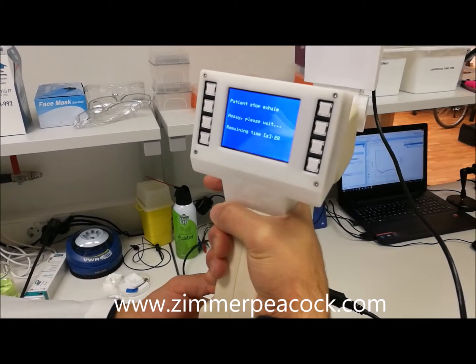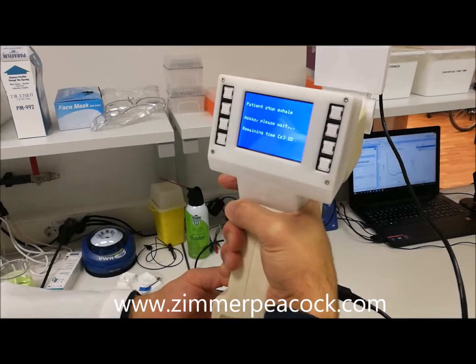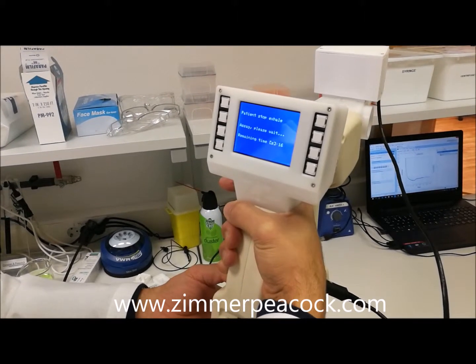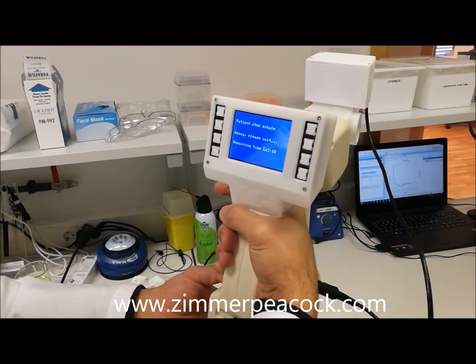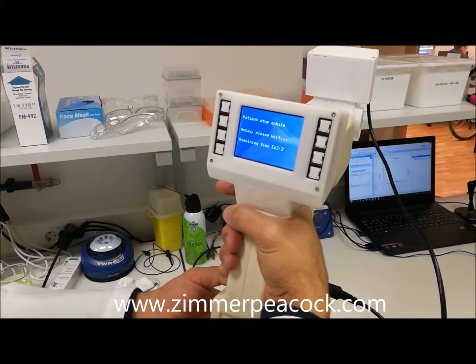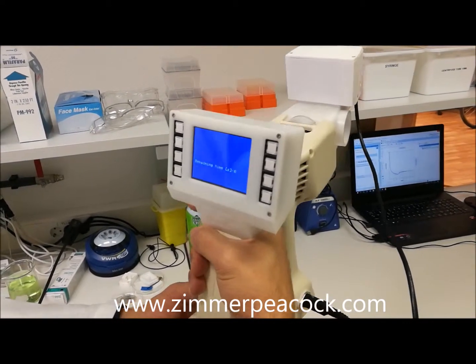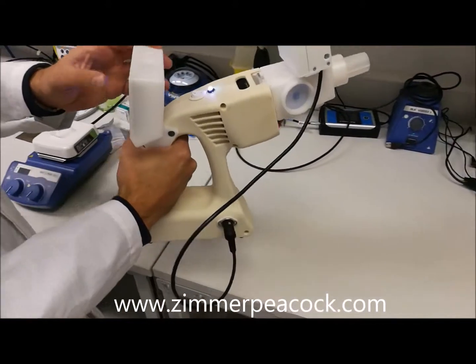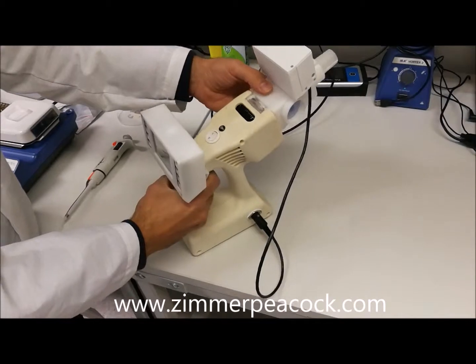Once the assay is finished, we can pipette the sampling fluid from her breath into a different beaker or device for a different analysis or analysis with different equipment. Ten seconds remaining. It has finished running the assay — it's complete. I'm not going to restart it; I'm going to turn off the device.